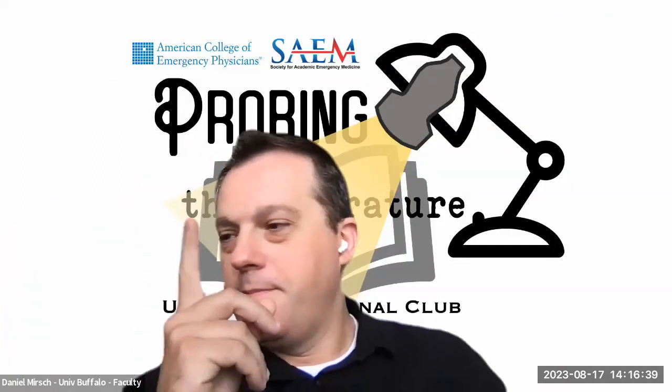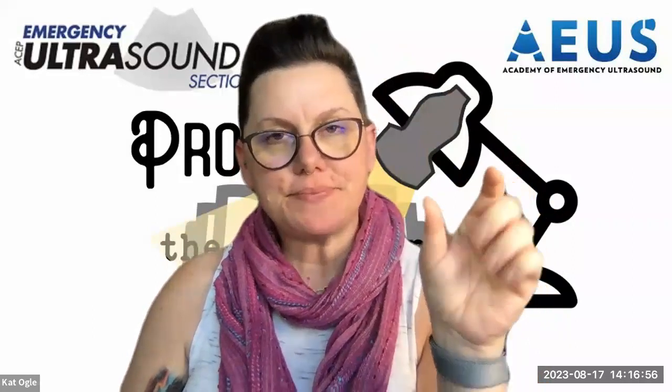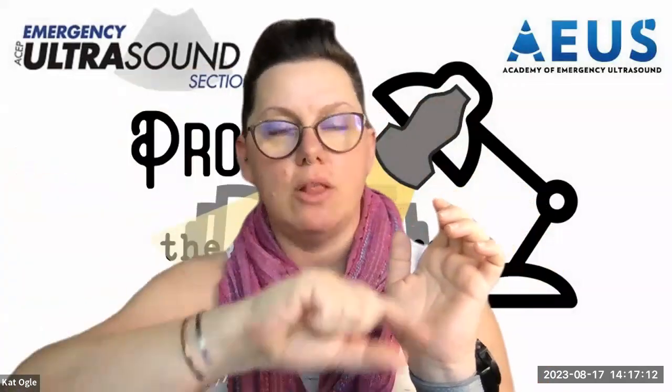I'll out myself as the dum-dum. What's the double line sign? So the double line sign, I think we cited an article that had pulled together a representation of the fascia that's around the kidney, adjacent to the liver and adjacent to the spleen, where there is this perinephric fat that is sort of outlined by that hyperechoic fascia. And so you literally have two parallel lines running right along the structure where you would expect your hepatorenal or your splenorenal recess to be. However, it's hypoechoic, not anechoic, and it's uniform as opposed to tucking in and being triangular.